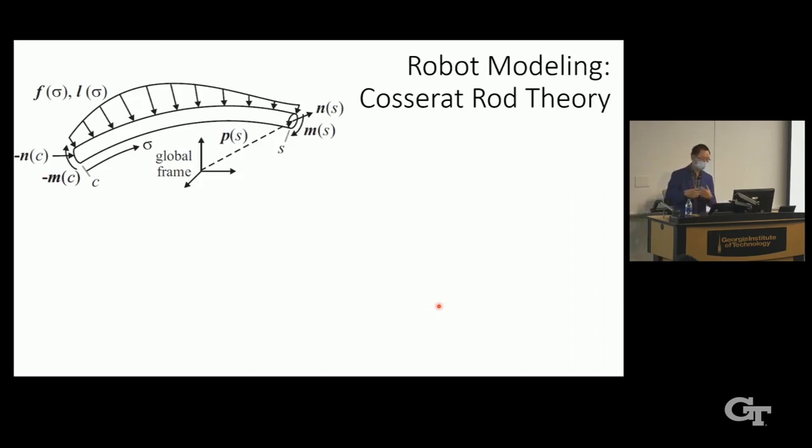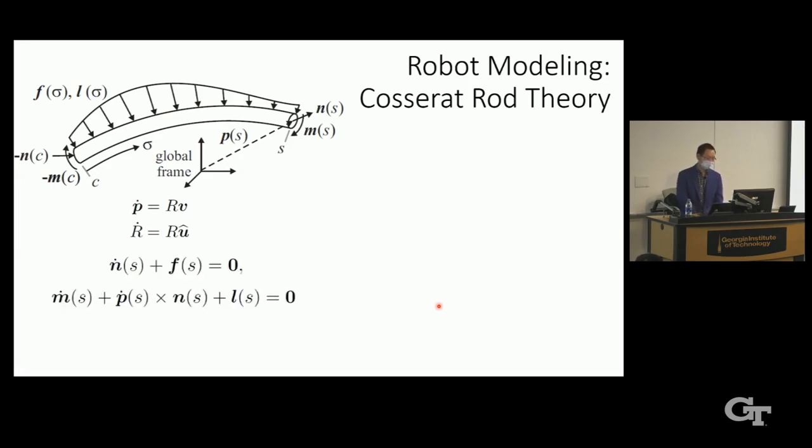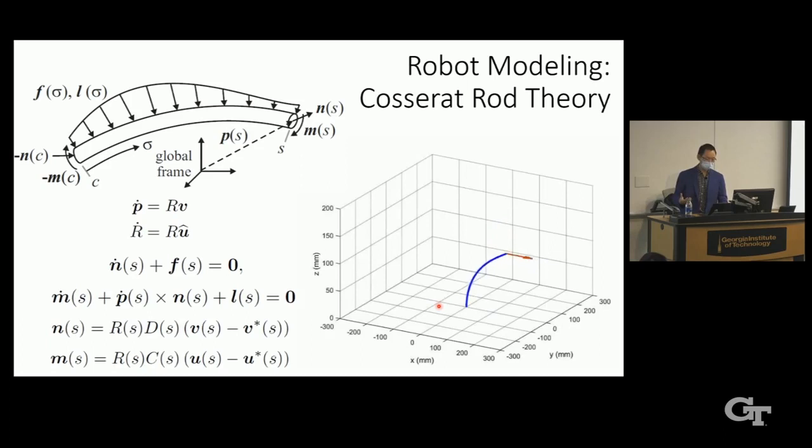So it's very lengthy derivation, but here I will just show you some very basic ones. First of all, we need to consider the kinematics, and second, we will also need to consider the mechanics, and lastly, we need to consider the constitutive laws. If we combine all these 6 differential equations together, we can solve a slender rod deformation subject to the external force or the internal force. Here is a demo that shows once we apply the force at the tip of this soft rod and also at the body of this continuum arm, how the deformation will become.